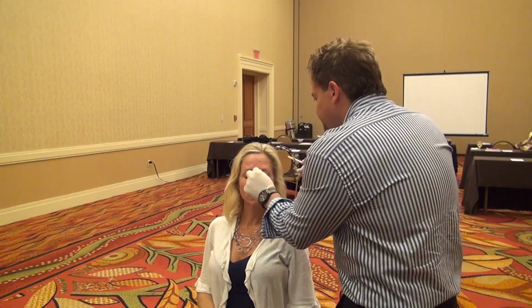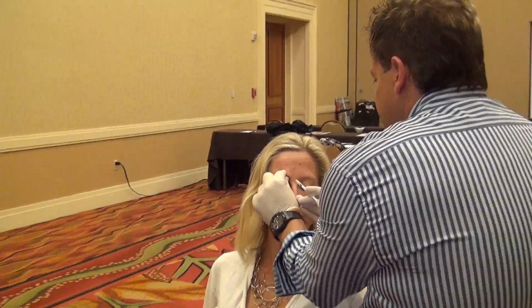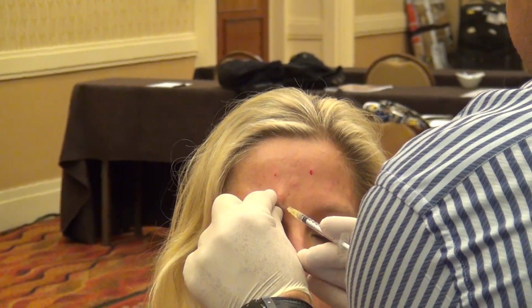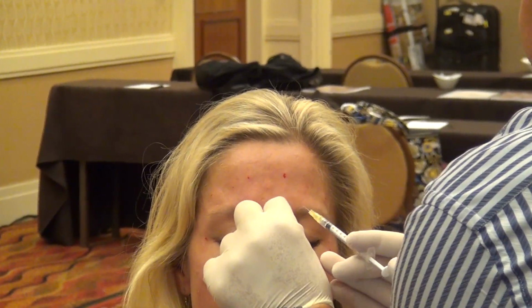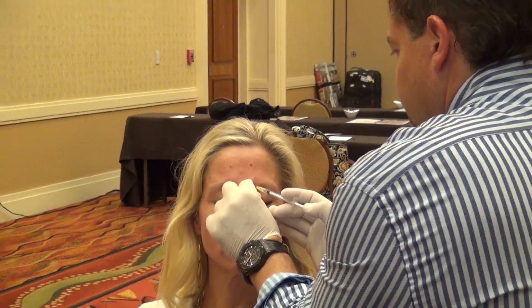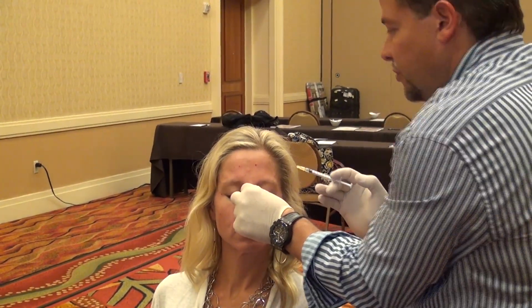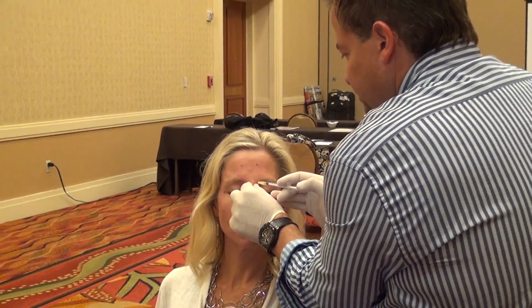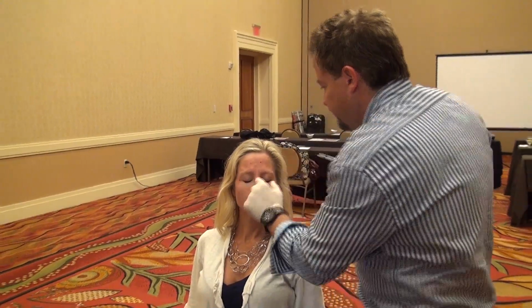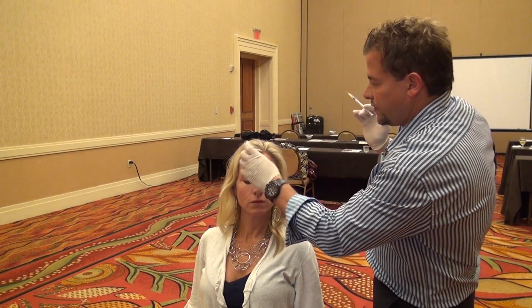And then in the center, it's the pinch technique. So you pinch the corrugator like this. In there. Same thing on the other side. And then in the middle. Okay, what muscles in the middle again? 2 muscles, right? Procerus and the depressor supercilii. So you want to get this whole area in here. This is all the glabellar region.